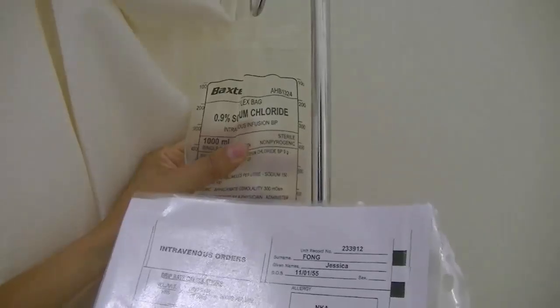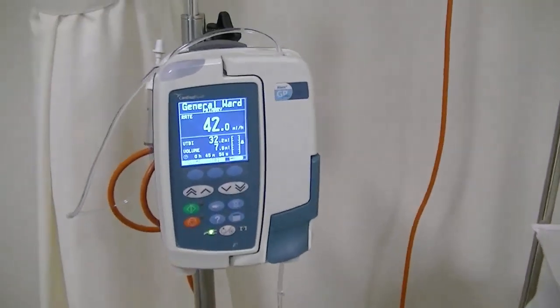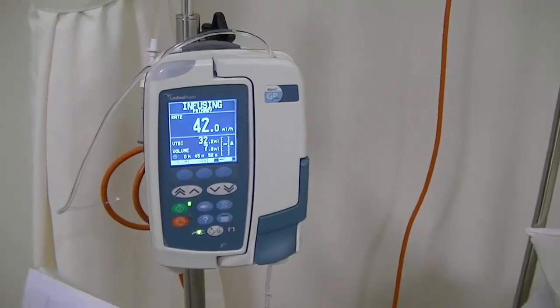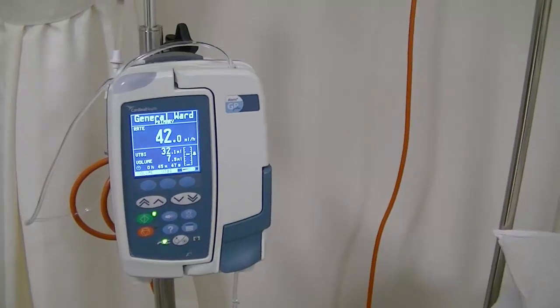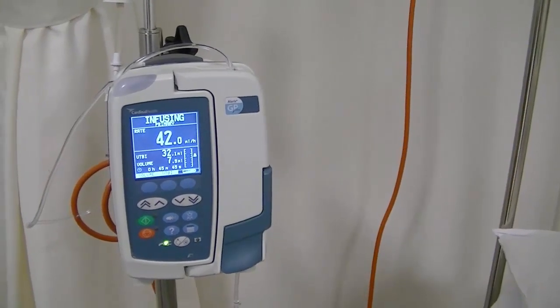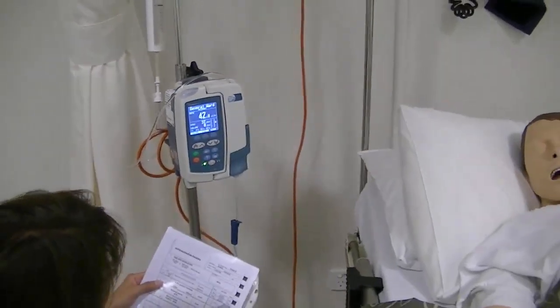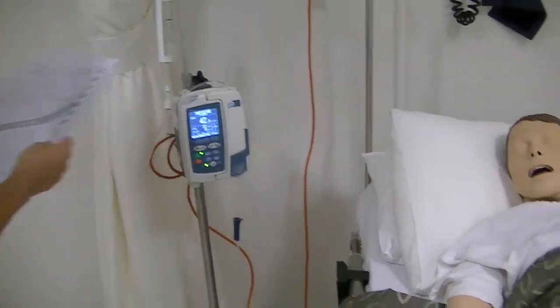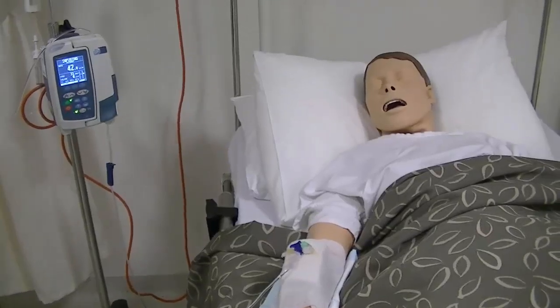So I've got normal saline, 0.9% sodium chloride, 1,000 mils. It's in date, 2016. It doesn't look contaminated. If I go down to the pump, according to my calculations, it should be running at 83 mils per hour, and it's not. It's running at 42 mils per hour. So I need to report that and change that. But in the meantime, I will administer this drug, so it will be running at a different rate for the time being anyway. Okay. Are you okay still for me to go ahead with that, Jessica? Yeah, no problem. All right.